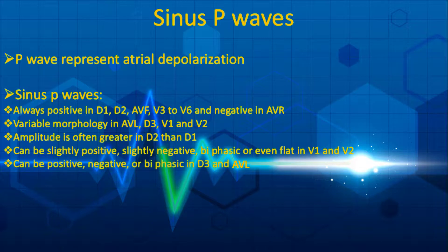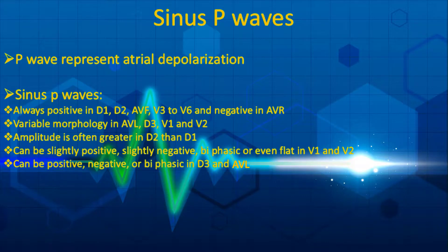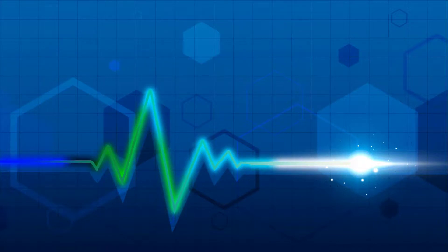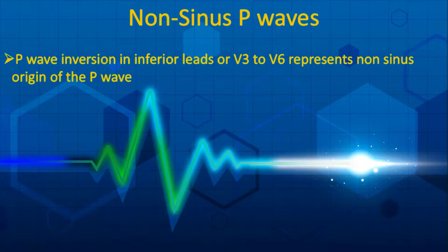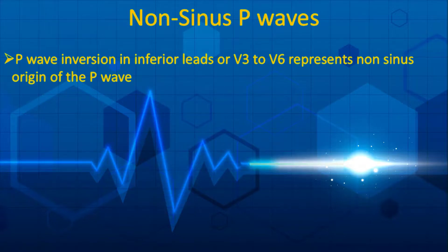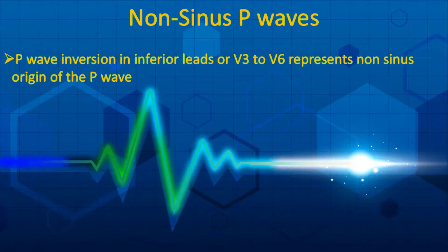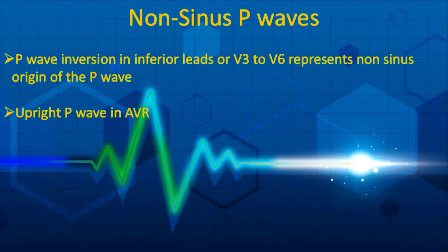The P wave can be positive, negative, or biphasic in D3 and AVL as well. In summary, P wave morphology is variable in D3, AVL, V1, and V2. P wave inversion in inferior leads or V3 to V6 represents non-sinus origin and is observed in ectopic atrial rhythm. An upright P wave in AVR is another finding of ectopic atrial rhythm.